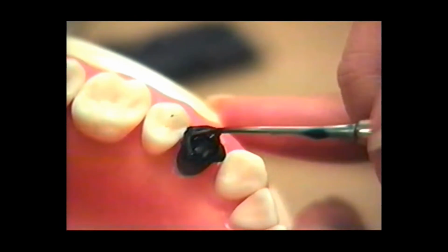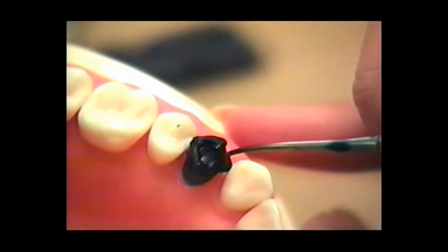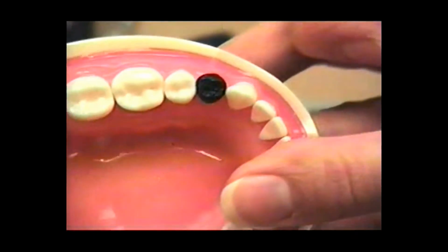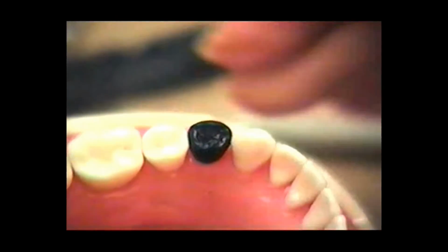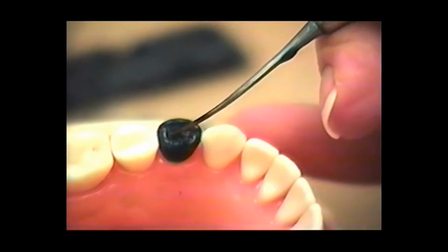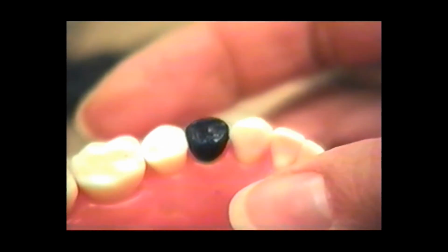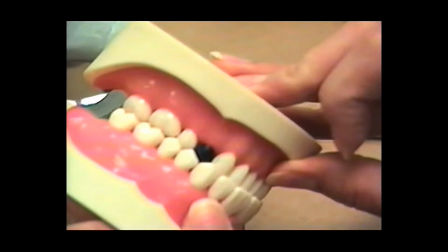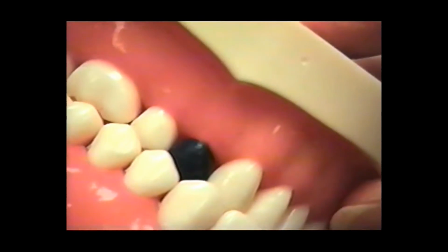And if you do that and you develop your marginal ridges at the right height, what you end up with when you're all done, and I've carved back a little and refined embrasures on this, is something that looks pretty close to what you want for your occlusal anatomy too. As you add your marginal ridges, make sure that you do close your typodont together. Bring your two pieces of your typodont together and make sure that you're not developing something that's too high.